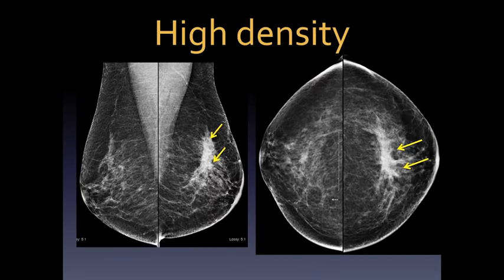Here is another example — a patient who had prior right breast surgery with architectural distortion from post-surgical changes. She also had architectural distortion on the left, where these lines gather into a center area, representing a contralateral invasive ductal carcinoma. The area on the right also turned out to be recurrent breast cancer in the surgical scar. Architectural distortion is something to train the eye for as one of the hallmarks of malignancy, especially in women with dense breast tissue.